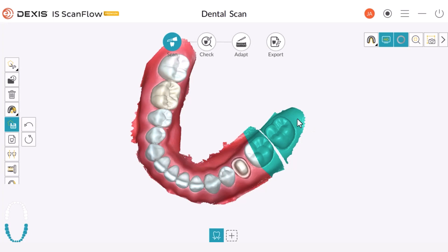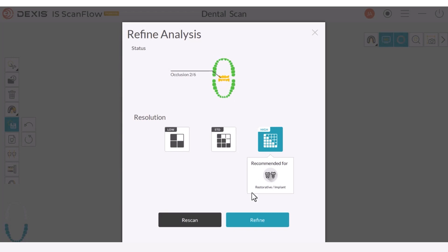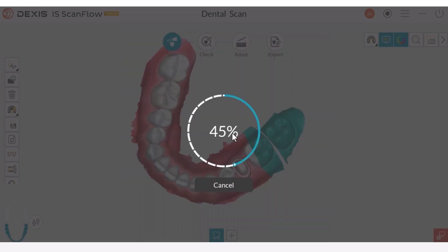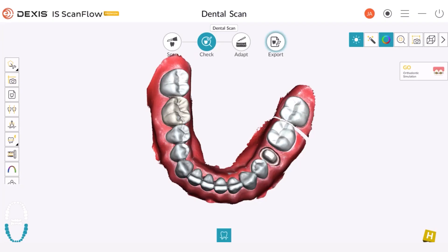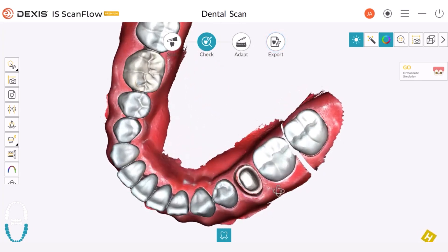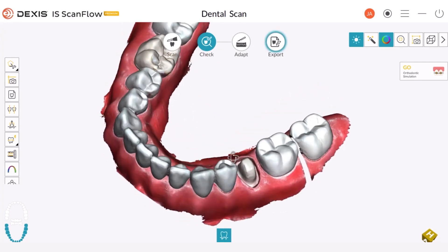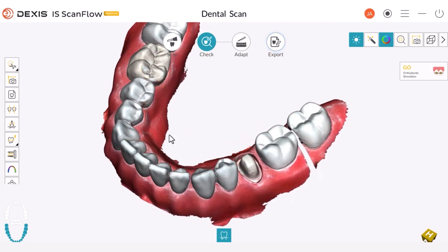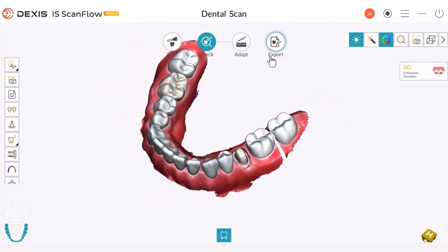Remember that once you highlight an area, you can always click Select Last Area or Unselect All if you made an error with the area you wanted to highlight. If everything seems fine with the area you highlighted, you can proceed to the check step. The software is now refining and it will keep the area you highlighted even if it's not connected. As you can see, we are in the check step and the tooth is not missing — it's just disconnected between the edges of the tissue. The disconnected area is still there and you are now able to send that case to the lab with all the information needed.